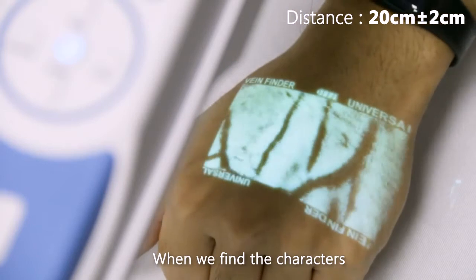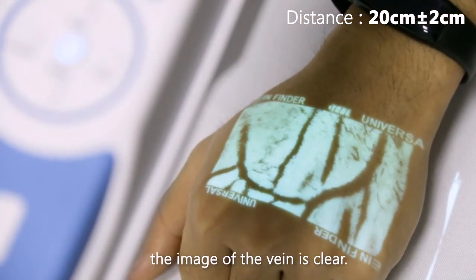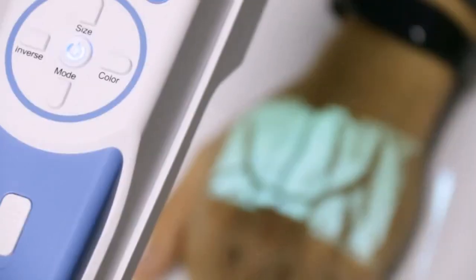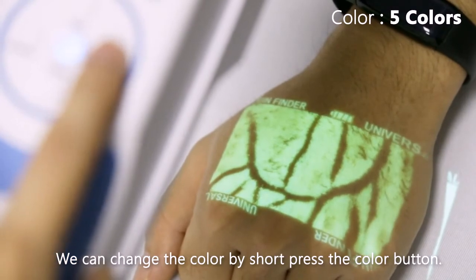When we find the characters in the vein image are clear, the image of the vein is clear. There are five colors available; we can change the color by short pressing the color button.